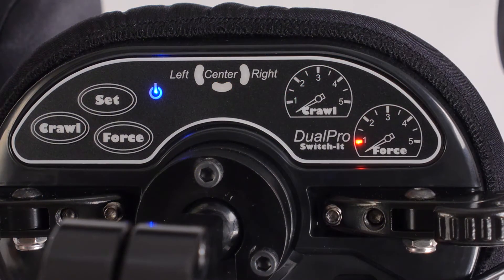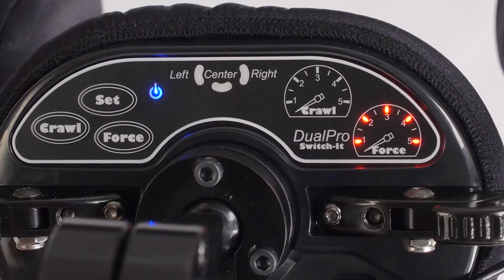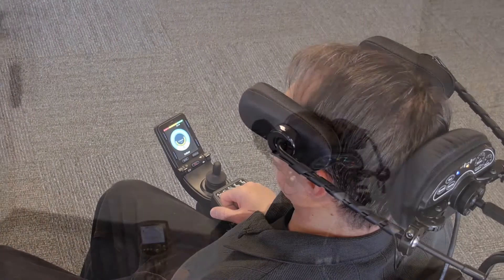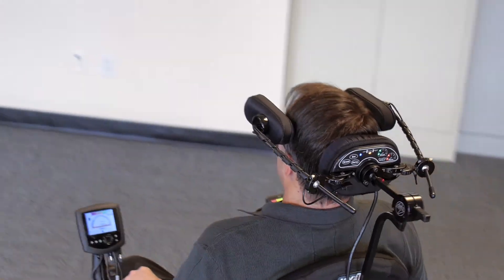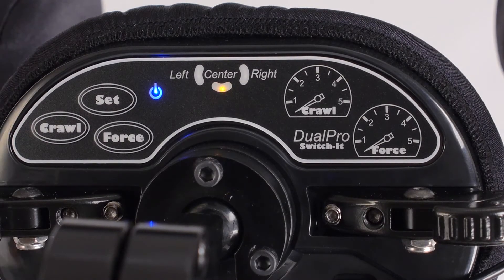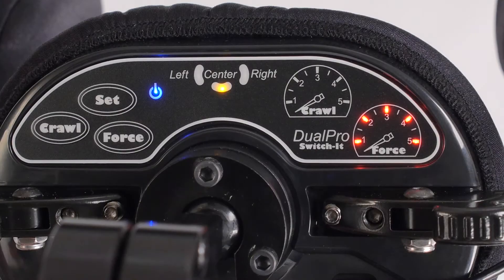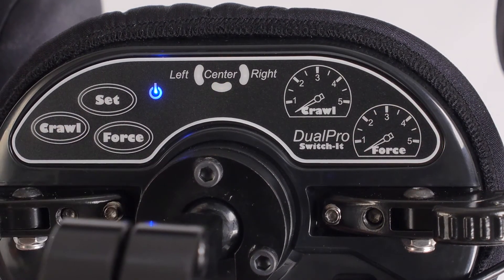If only one light is lit, it takes very little force to reach full speed. If all five are lit, it takes a significant amount of force to reach full speed. Utilizing all five lights also helps ensure a more gradual acceleration. Like Crawl, force is set by pushing the Force button in the programming mode. Each push adds a light until all five are lit. The next push cycles the settings back to zero.